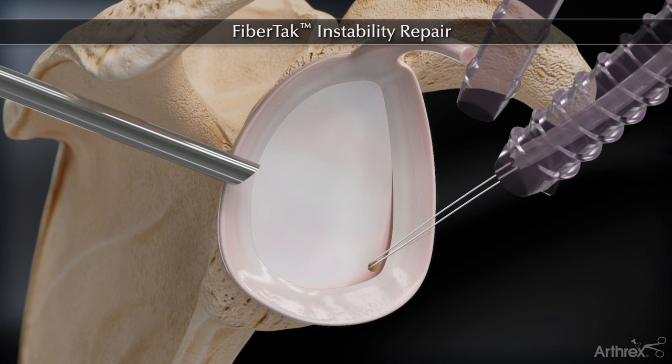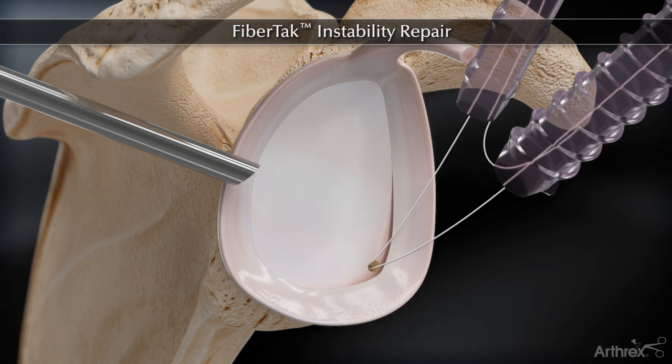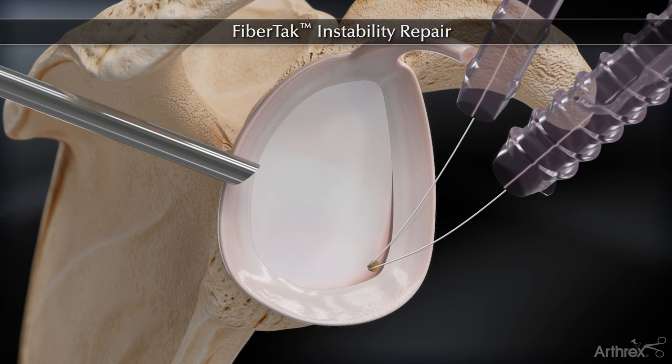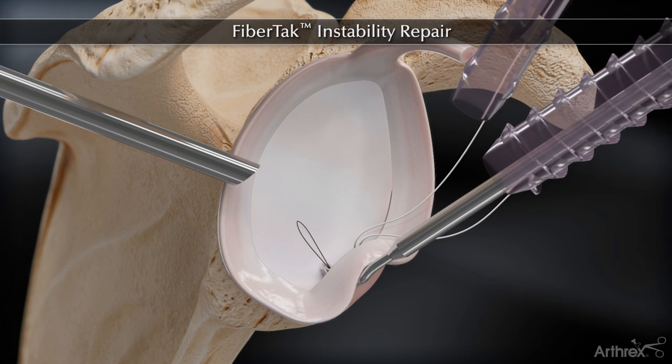One end of the suture tape is retrieved out of the anterior superior portal with a suture retriever. The suture tape is then passed through the labrum using a quick-pass suture lasso.